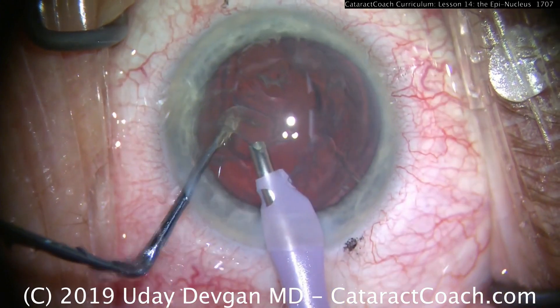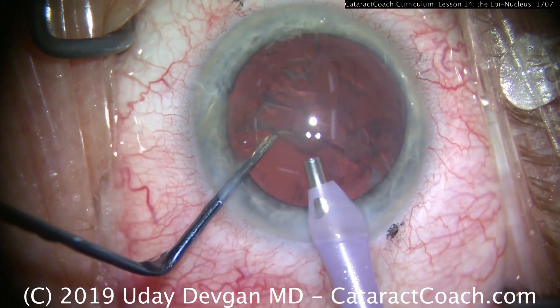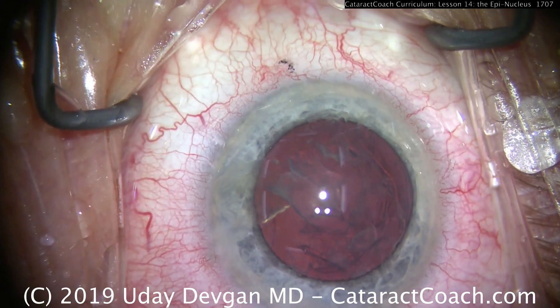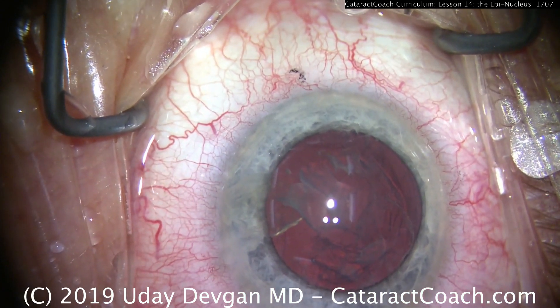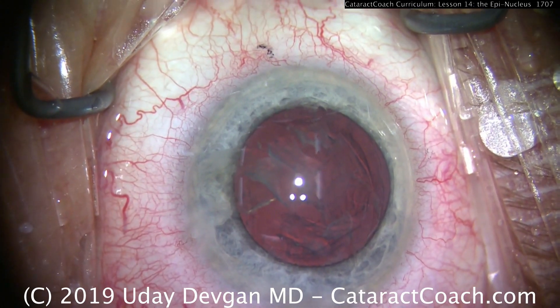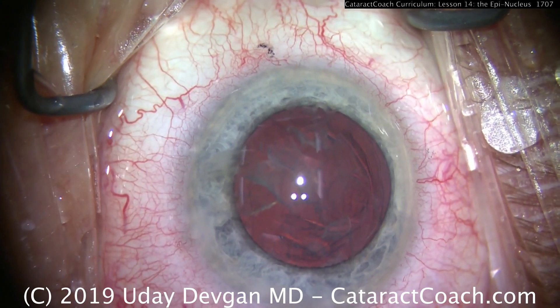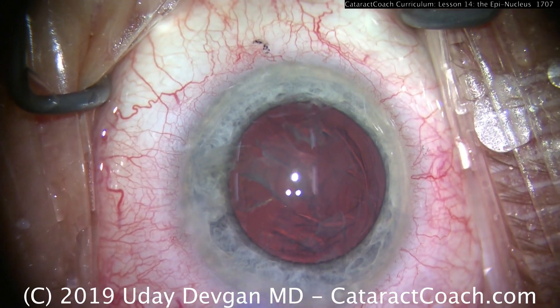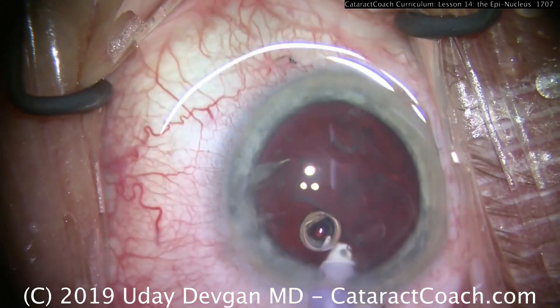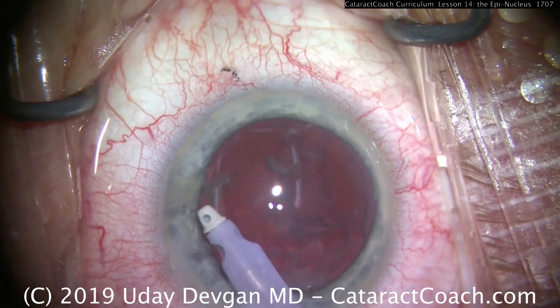Let's look at one more case — taking out the remainder of the endonucleus. Here's the shell. Look at the chopper position — it's in a safety position to help protect the posterior capsule. Do you need a separate epinuclear setting on your machine? You don't have to. I typically don't use one; I can just control the level of aspiration via my foot pedal, leaving it on the typical setting. Some people like an epinuclear setting with lower flow or lower vacuum, and that's reasonable too — it's surgeon preference.